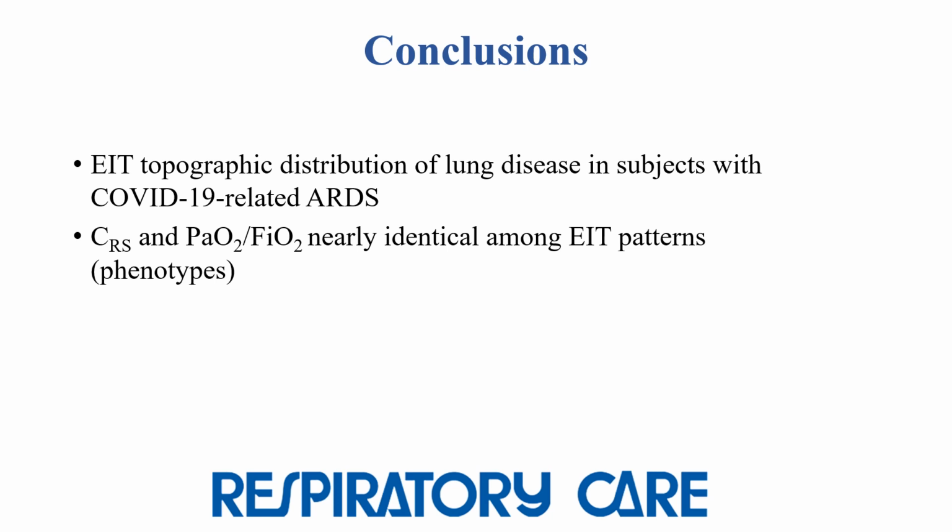In conclusion, this study demonstrated EIT topographic distribution of lung disease in mechanically ventilated subjects with COVID-19 related ARDS. Respiratory system compliance and gas exchange were mostly similar among the different EIT patterns.